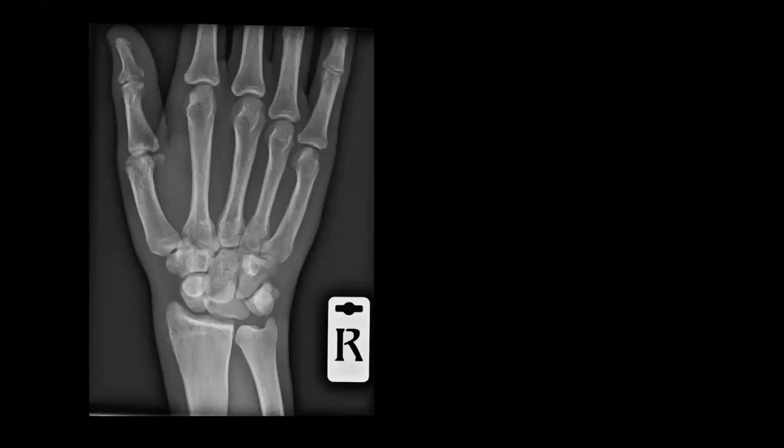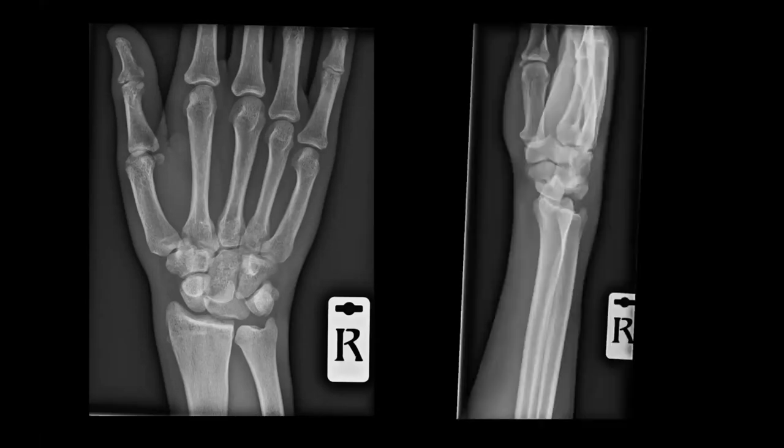One of the dangers with perilunate injuries is that you can have a pretty innocuous looking PA radiograph. So this is a PA radiograph of a patient with a perilunate injury. And it's only when we refer to the lateral radiograph that you can see that the capitate has dislocated relative to the lunate. And this is one of the reasons why understanding perilunate injuries is important.